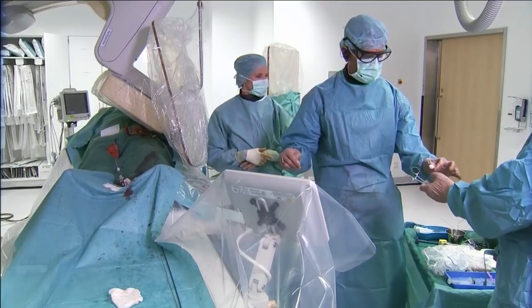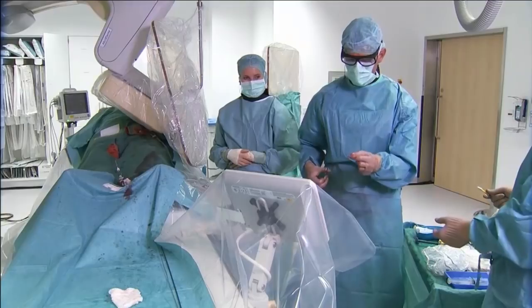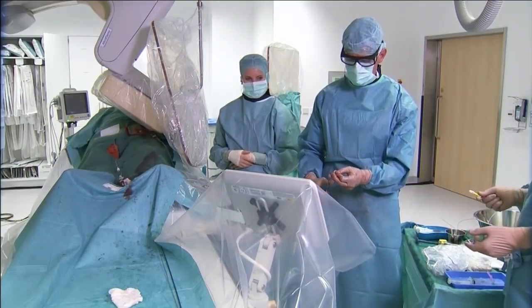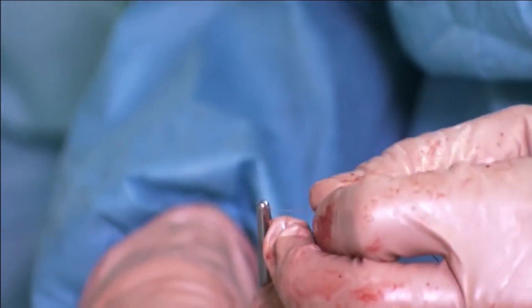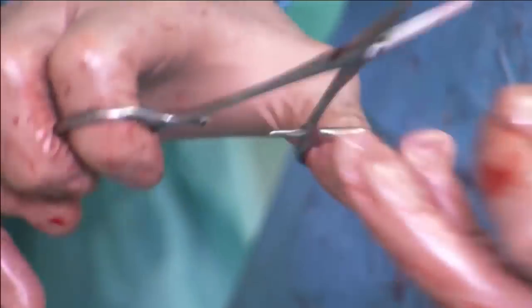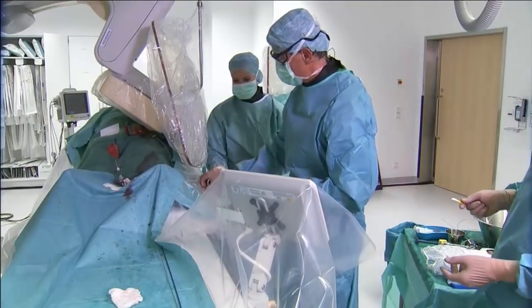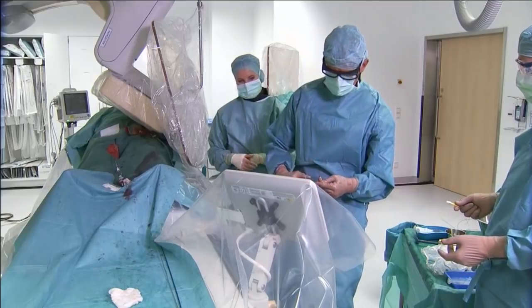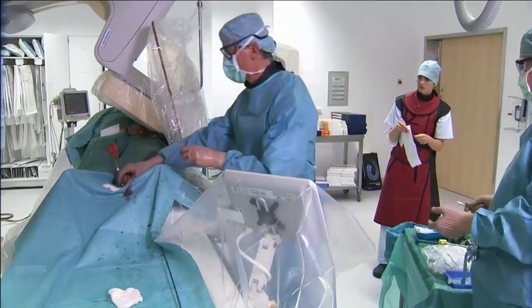Yeah, it's any 014 wire because the back ends are usually all the same. This clamp doesn't work. To make a little angle in it, something like this. Sure. Something pokey which will drill.